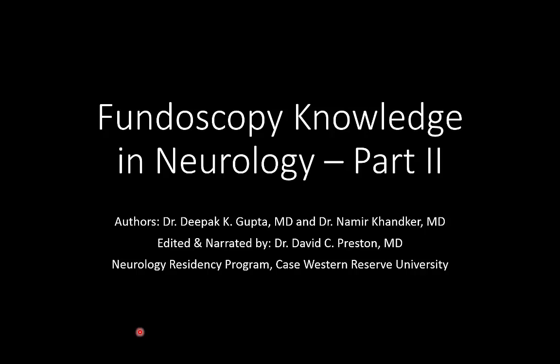So this ends Fundoscopy Knowledge in Neurology Part 2. Feel free to watch this as many times as needed. The most important finding by far is papilledema, which we want you to be able to recognize, followed by an increased cup-to-disc ratio, and then know the major pathologies of hemorrhage, of cotton wool spots, of what a central retinal artery occlusion looks like, what a central retinal vein occlusion looks like, and what you expect to see in diabetes.